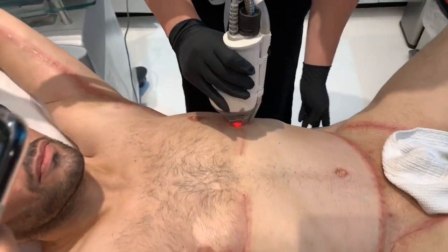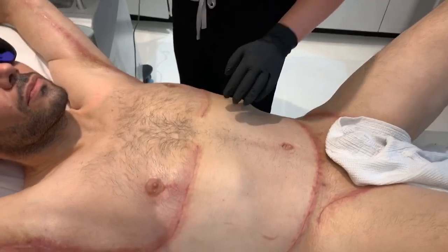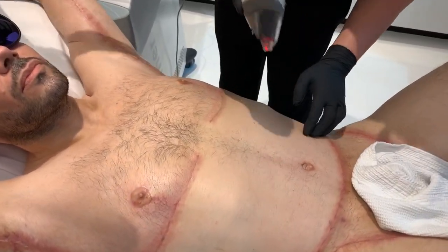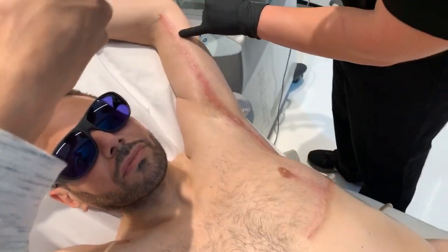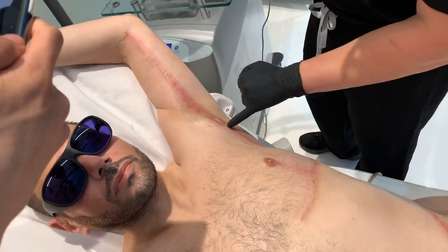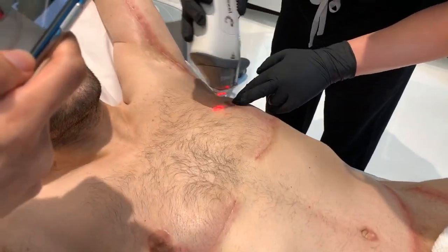So if the scar was going to take a year to heal, it probably is only going to take 6 months to 9 months with the laser. So you guys can see here, look, now all that redness is popping up because of the swelling and the heating in there. Now I'm going to do a little bit around the edge of this nipple.